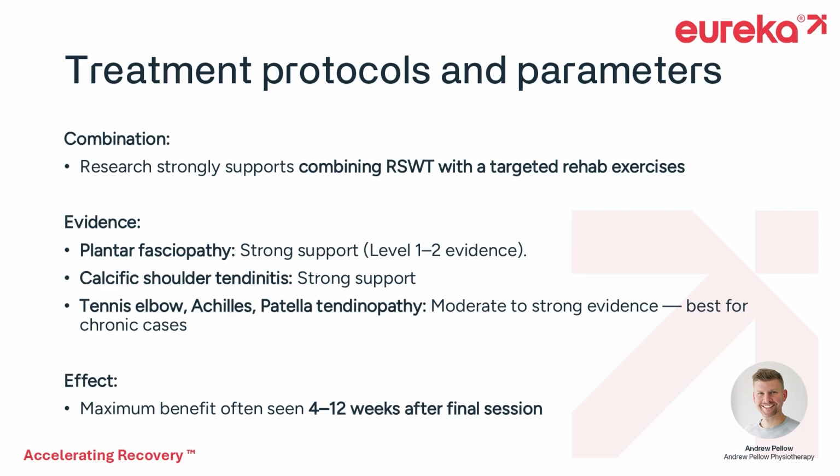Effect. Maximum benefit is often seen 4 to 12 weeks after the final session, due to tissue remodeling, which continues for several weeks after the final shockwave therapy treatment session.